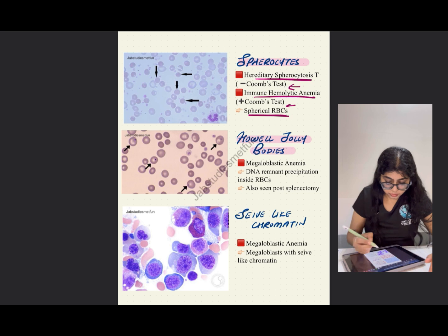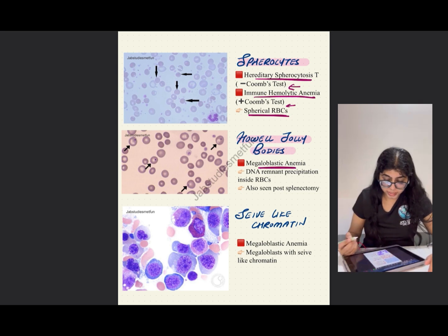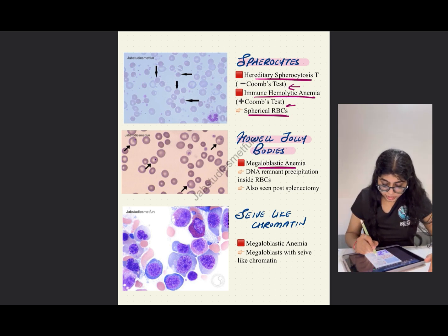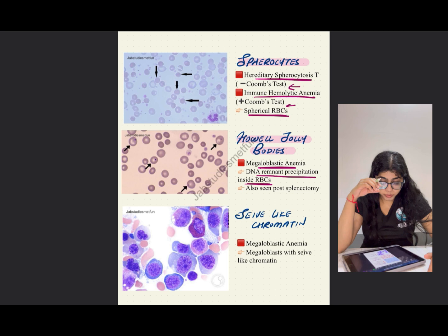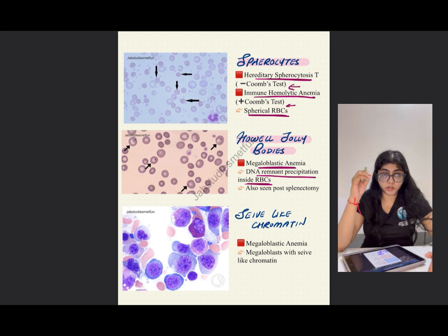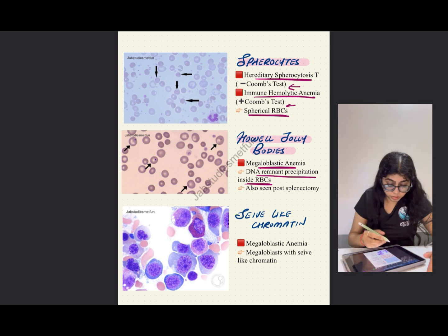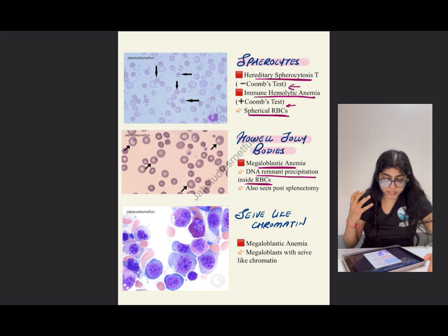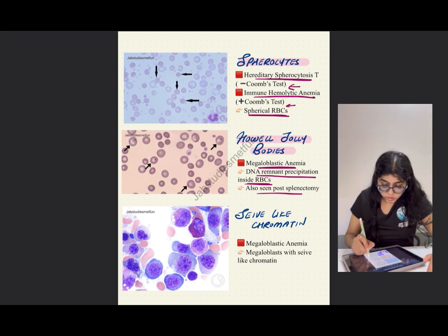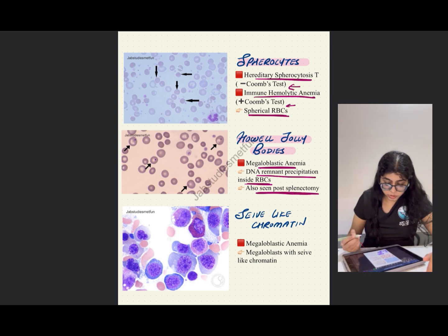Howell-Jolly bodies are seen in megaloblastic anemia. There is a DNA remnant precipitation inside the RBCs — similar to Heinz bodies, but Howell-Jolly bodies are more towards the center and represent DNA remnant precipitation. They are also seen post-splenectomy.